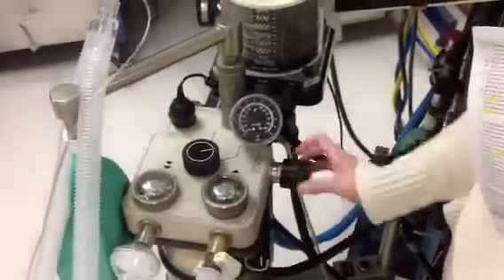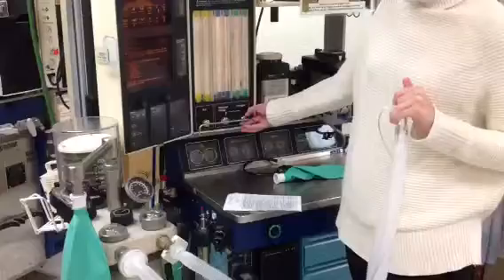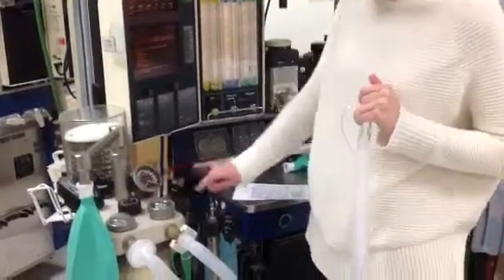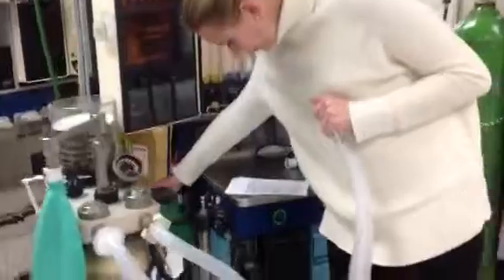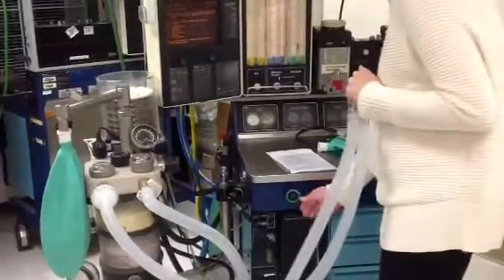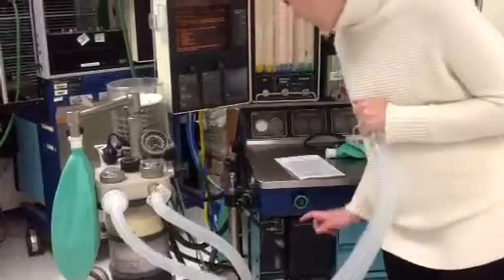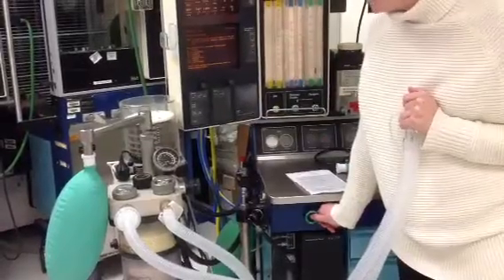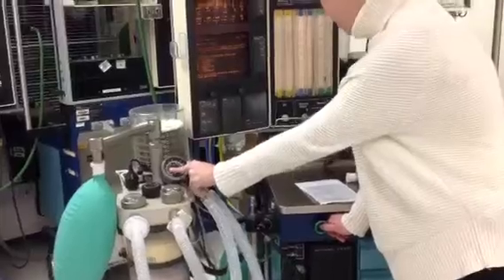Come back, go to your APL valve, make sure it is fully open, lefty-loosey all the way. Occlude your Y piece and put your fresh gas flow to minimum, so 1 liter to 2 liters. Make sure that the pressure in the gauge is 0 and that the bag has fully collapsed. Then, with the O2 flush activated, allow the scavenger reservoir bag to fully distend and make sure the gauge reads 10 centimeters of water, or less than 10. So we're good. If you see here, it says less than 10.